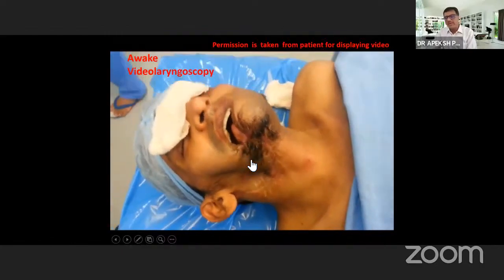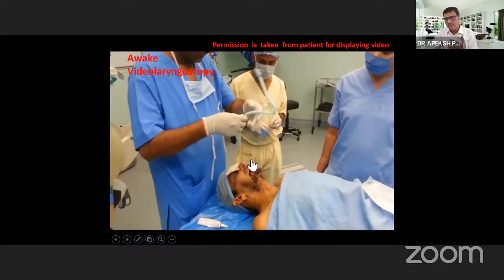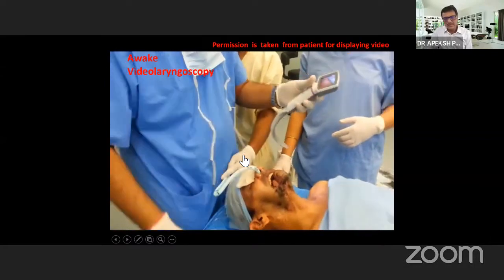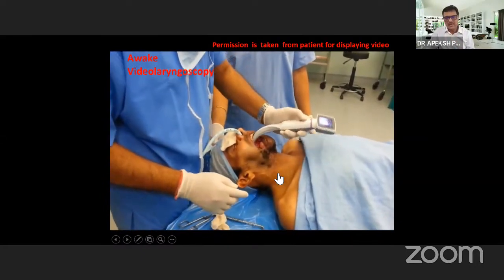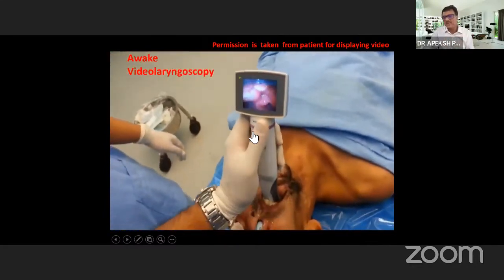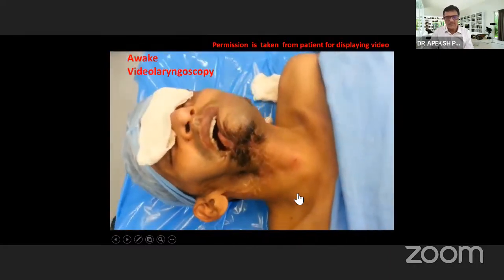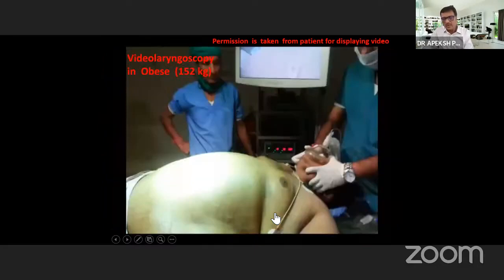This is one of the videos of performing awake intubation in a post-mandibulectomy case for redo surgery. It's a nasotracheal intubation. We have used the non-channel video laryngoscope blade, passing a tube through the nasopharynx and asking the patient to open the mouth. We have given bilateral superior laryngeal nerve block and transtracheal spray. Look, I'm not giving any force. Able to see the vocal cord and epiglottis. So with a hyperangulated blade, it's possible to intubate in the awake state, and you can even intubate in a neutral position also.